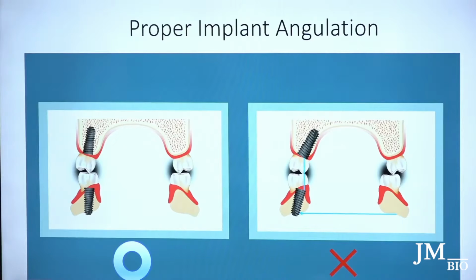Even with your first drill, second drill, remember the parallel guide we're using and stuff like that, right? Most people skip steps. Most people don't do it, and even though they're not very good, they still skip the steps. They shouldn't. You should try to maintain the basic principles all the time, okay?